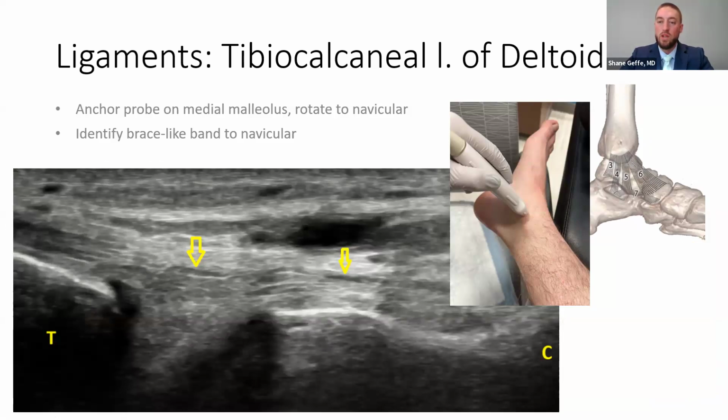Again, what I like about this is if the foundational anatomy that you have as a clinician, fellow, resident is sound, all you're doing is looking at bones and trying to find the connection between them. So it becomes much easier when you take the entire picture out of it and just recognize that you're looking in this view for the tibia as well as the sustentaculum, which is part of the calcaneus.